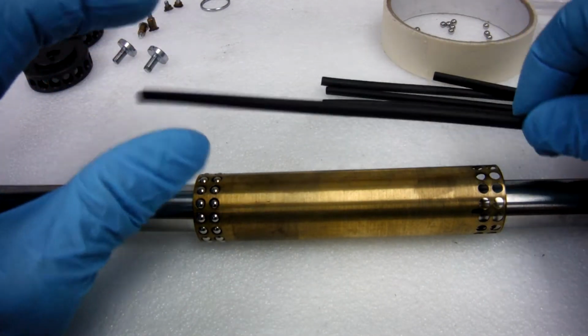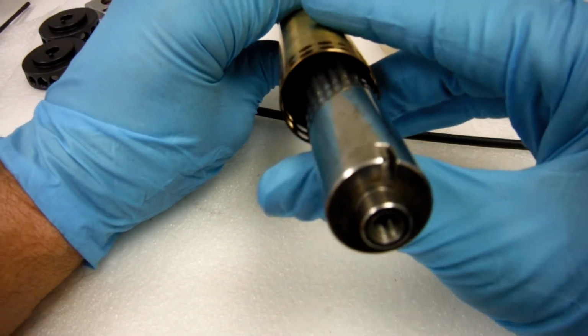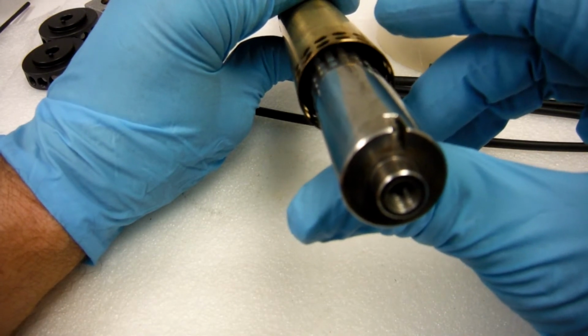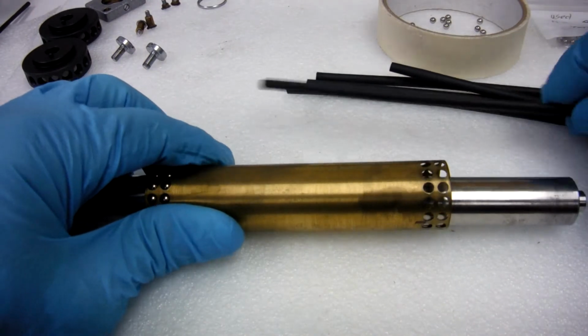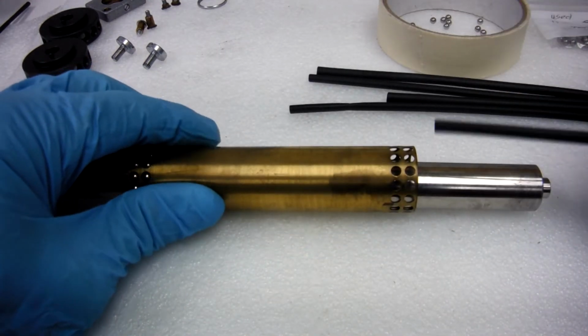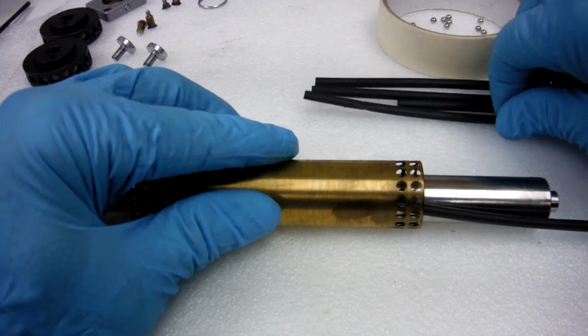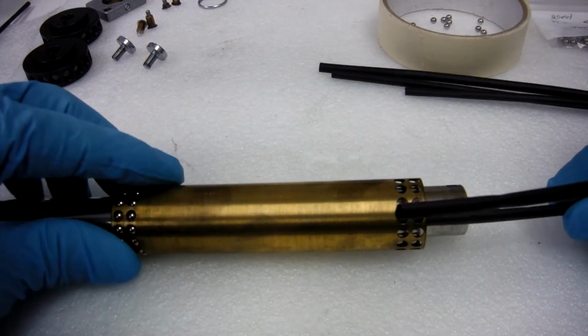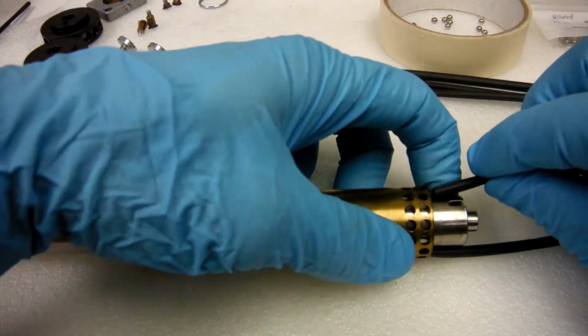Something to keep your cylinder round while you're slipping your bearings in. So I'm using 1/8 inch, and here I'm going to put in about 4 or 5 to keep it spread out.